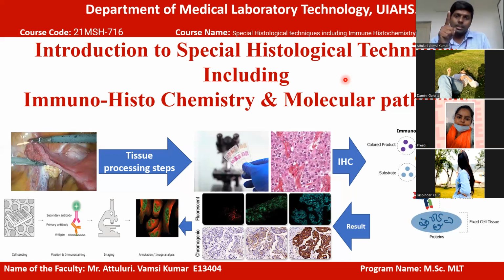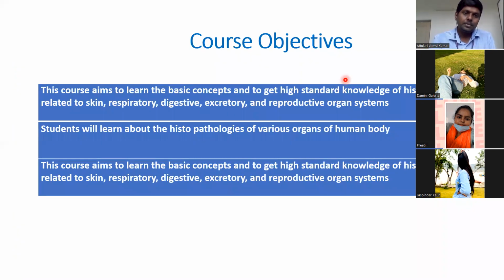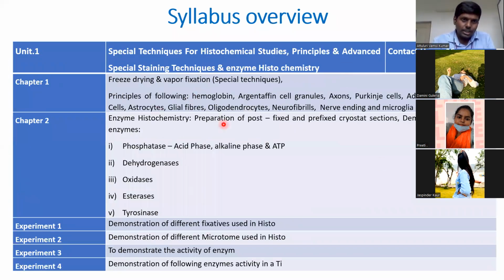And that question will be addressed by another branch of histopathology called enzyme histopathology. Enzyme histochemistry will try to give answers to this problem. Enzyme histochemistry will try to study the enzymes in the tissues, and the functional status of the enzymes within various tissues of our body.